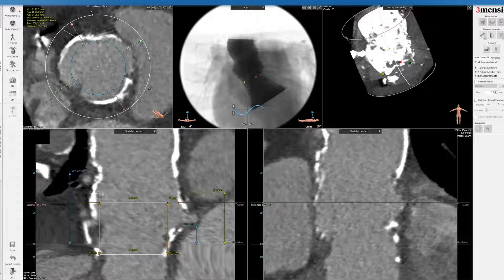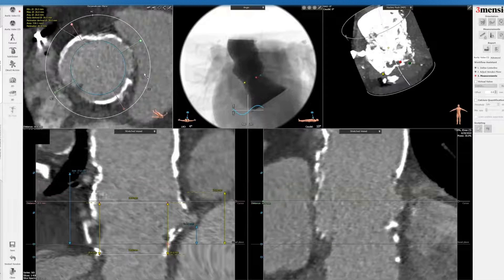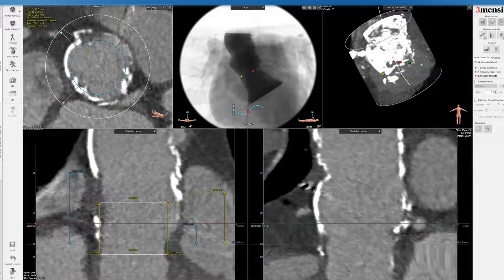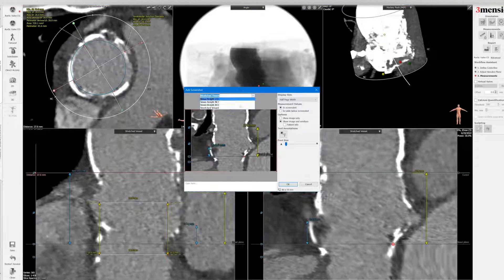Remember this depends on the height of implantation relative to the leaflet height of the homograft, so it's very hard to see here — this is not really the actual valve-to-coronary distance. I'll just delete that to avoid misleading someone. This is the left sinus left coronary measurement. The right is a little tricky — this patient had a vein graft to the right. You can see the coronary here — it's like a non-dominant right. This is actually the native right, and then there's a vein graft here.